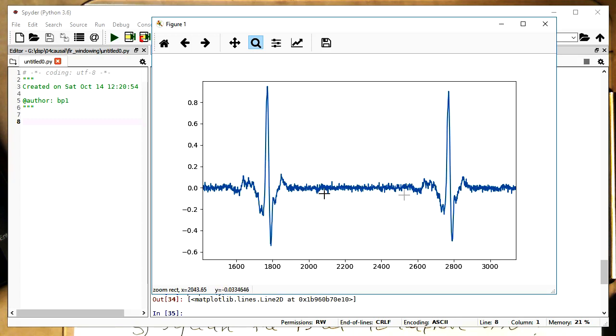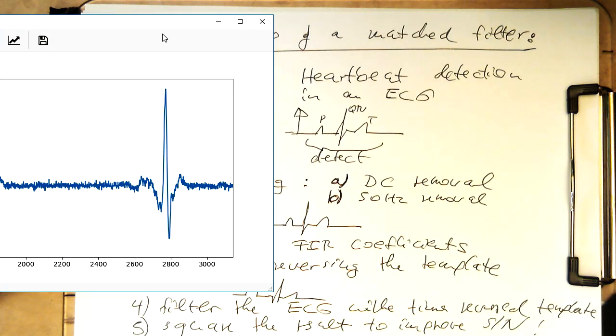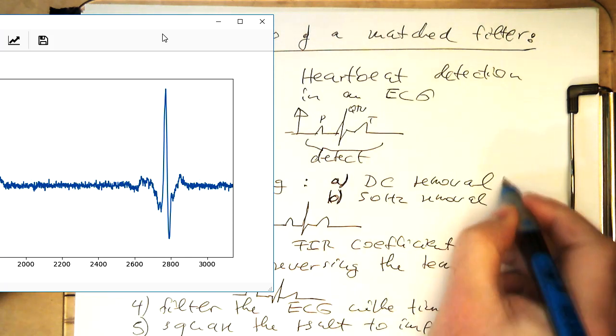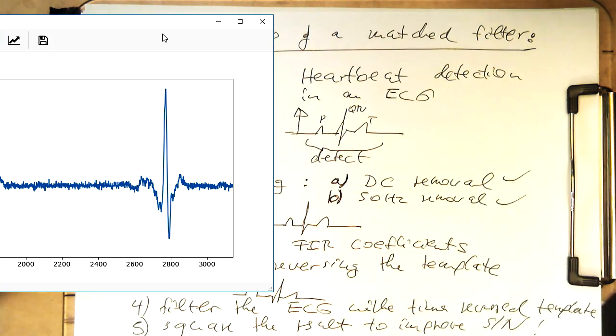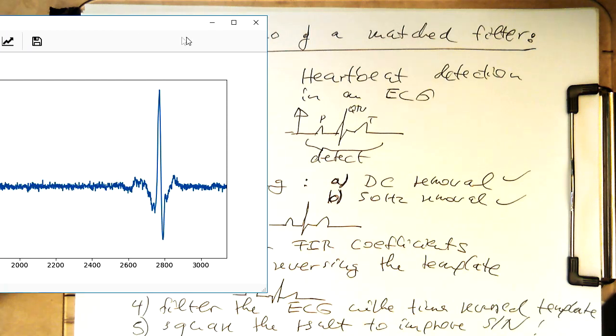And there's also no 50 Hertz in it. So we can tick that off. DC is removed, 50 Hertz is removed. And so we see we have a quite nice and clean ECG already here. So that's sorted.